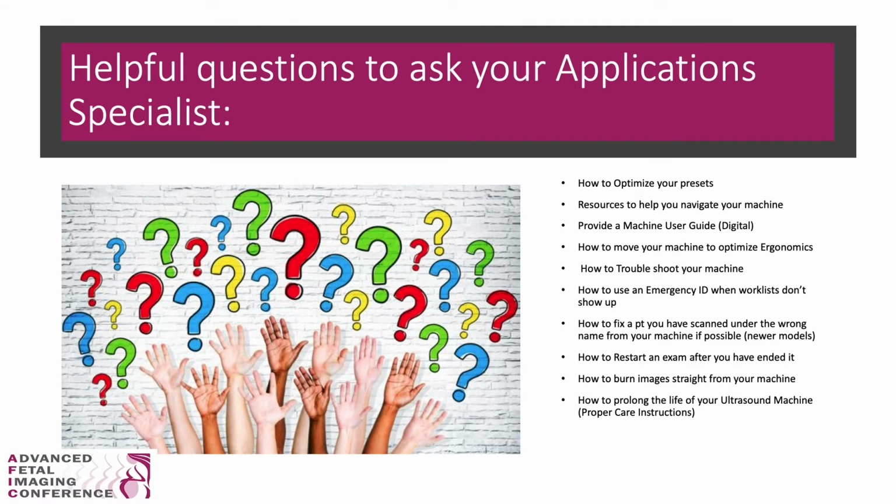It's always a good idea to have a prepared list for your application specialist to maximize your time together. These things on this list aren't everything. Feel free to add anything you want to know and send them this list a week in advance so that they can properly and efficiently answer all of your questions. It is also okay to ask them for a written response. This way you have those handy for when the specific issues come up.